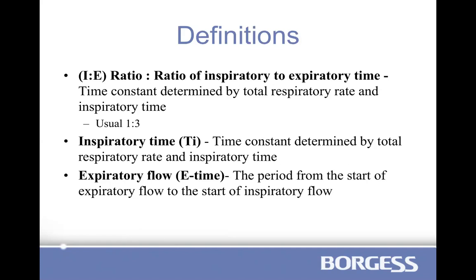But what I can't control is exhalation. The vent turns off and the patient passively exhales. The vent does not suck air out of the lungs. That is a passive process. So the vent is really only on during inspiration. I can control the time that I allow for expiration, but that is really the only manipulation of exhalation that we can participate in on the vent.